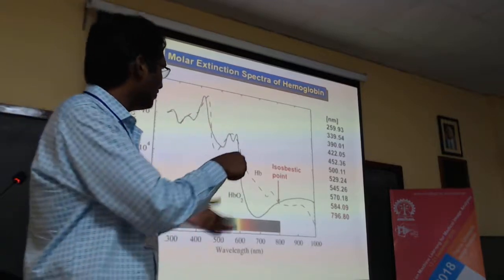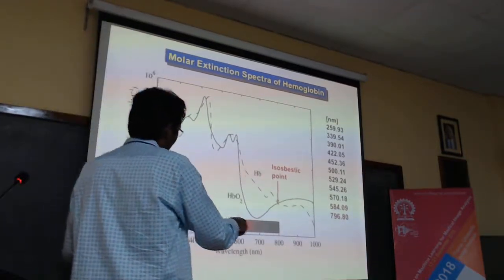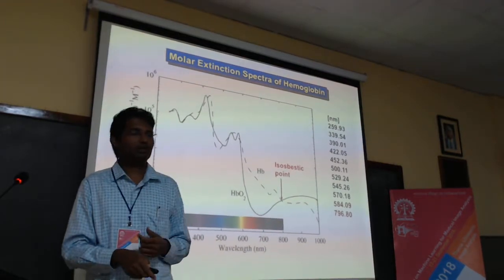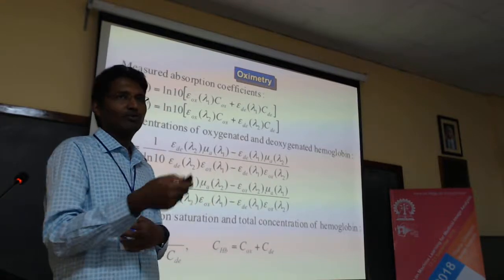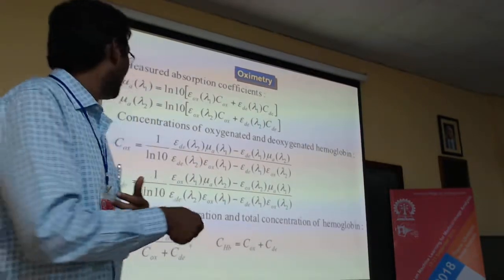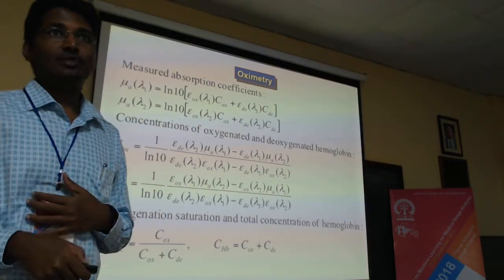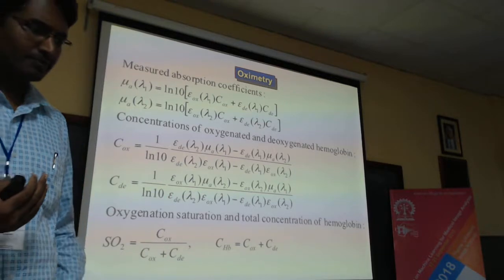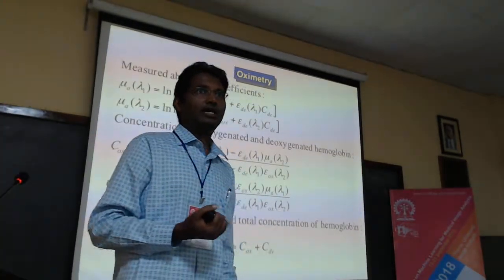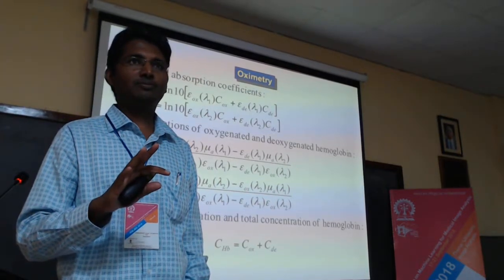If you use different wavelengths, that means it's going to give you different signatures. Obviously, we want to be in this range, typically between 600 and 1000 nanometers. Then we can look at the absorption at the different wavelengths, go back and look at the oxy signal and the deoxy signal, and distinguish between them, right? Now, where do you require deoxy and oxy? Has anybody gone to emergency rooms? Has anybody seen an emergency room? Right.